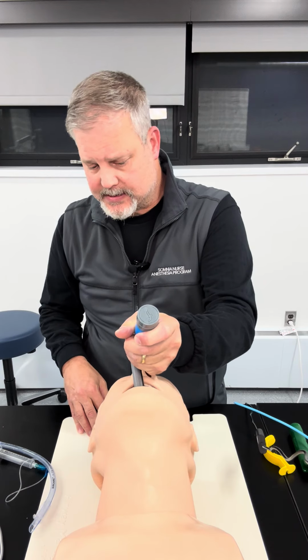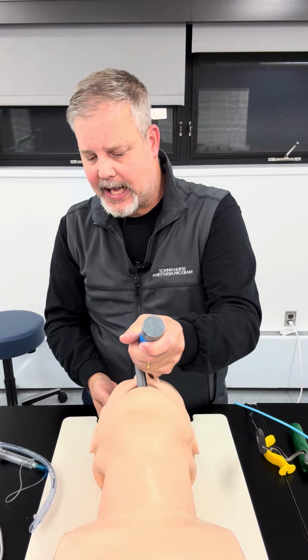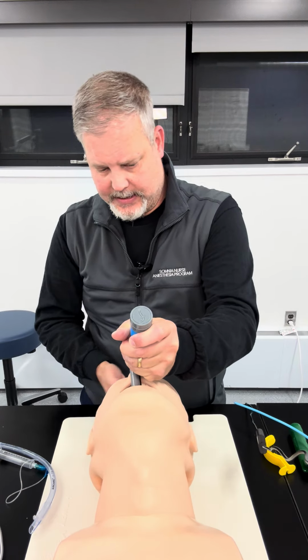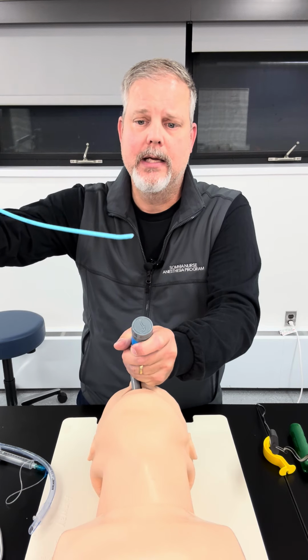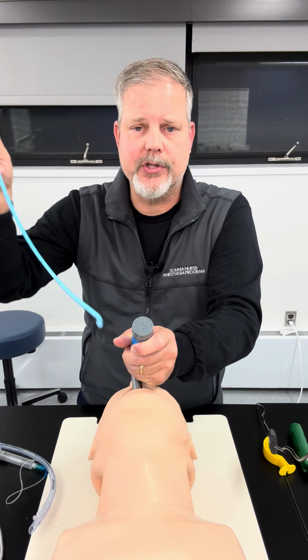So now what I'm going to do is say, okay, I see the vocal cords, but I don't feel like I have a great view to actually place the endotracheal tube. So what I'm now going to do is use my bougie. Again, somewhat of a good view, but not a great view. So now I'm going to be handed my bougie. And again, I want to use this end here, which has the curvature to it.